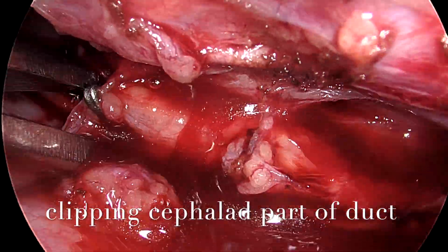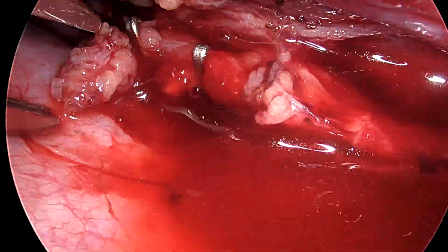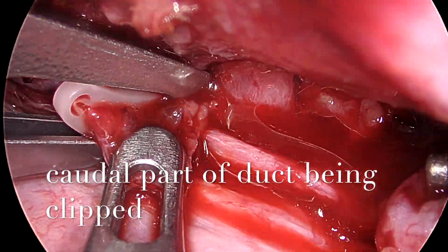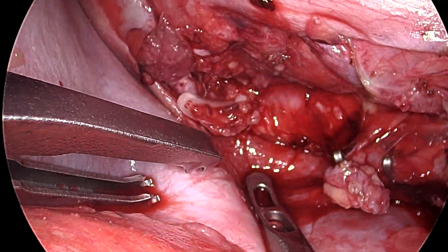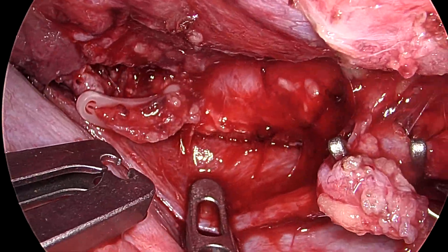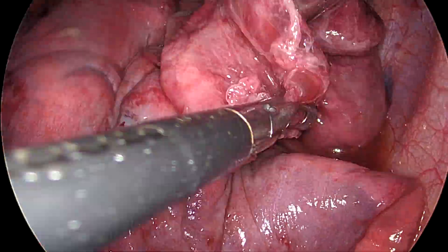Clipping of the cephalad part of the duct is now performed. The caudal part of the thoracic duct is clipped using a hemoclip. After clipping, we can see that there is no leak of fluid from the site of injury.